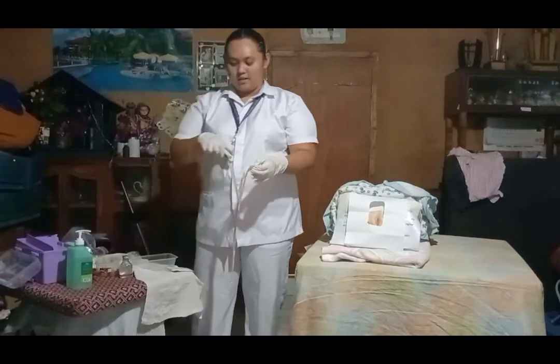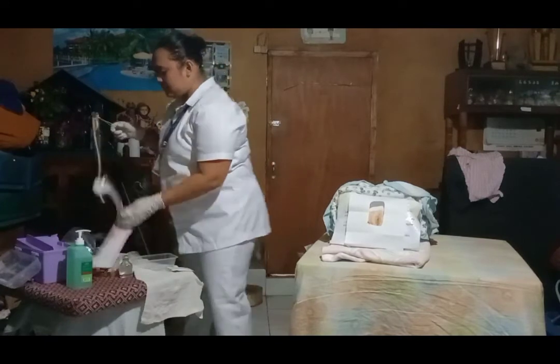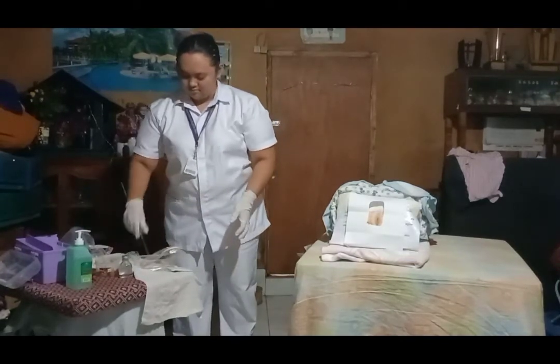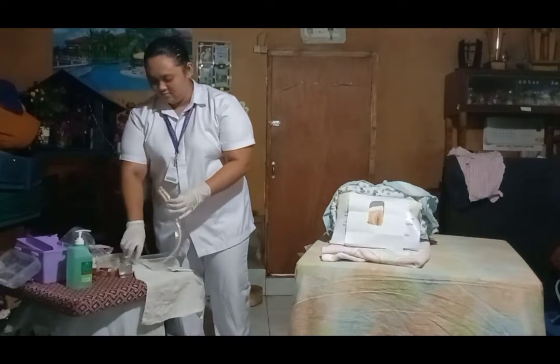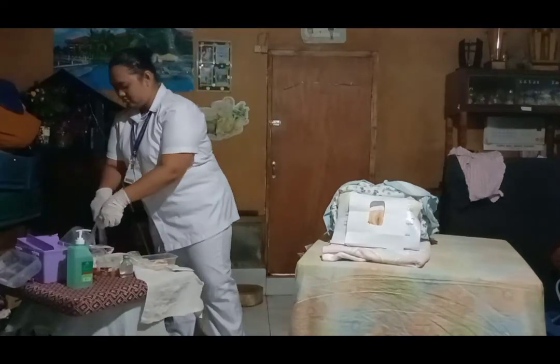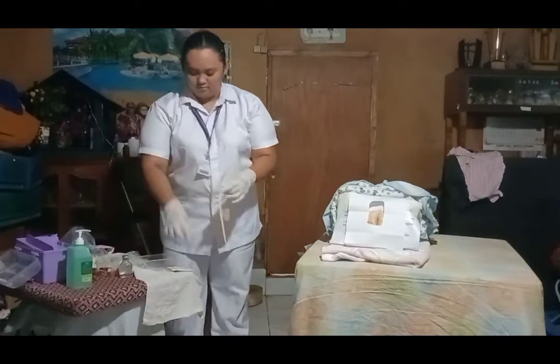So I'm going to pick up the catheter using my forceps so that it will maintain sterility. And then I'm going to lubricate it.